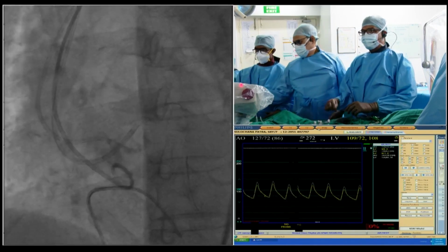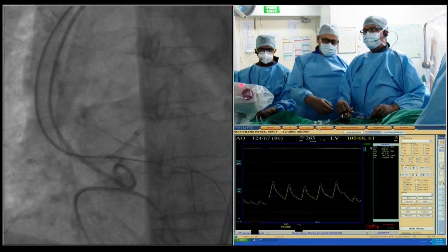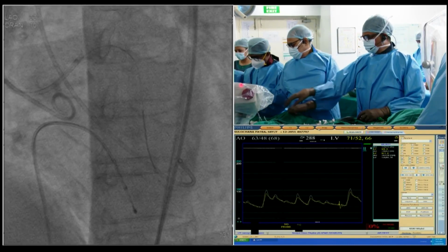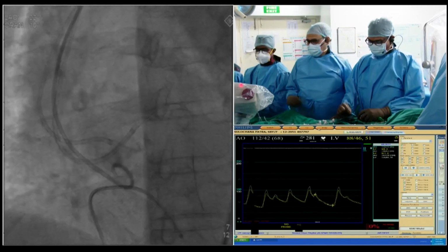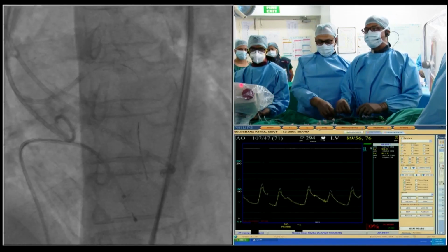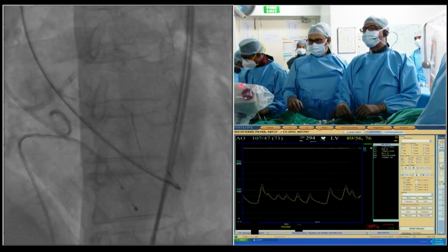Yeah. Yeah, you are in. So we are already crossed across. Just as you said, we thought we were off the camera. Yeah. No. We got that. So we've not yet moved to Gurugram. No, the wire listened, and as soon as it said, "Oh, I'm not on the camera," it was able to go transeptal. Yeah.